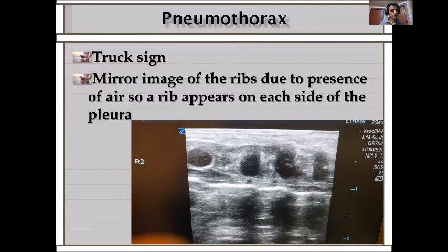The positioning. Remember, we will talk. We have 1, 2, 3, and 4. That's all it will do at this point. Don't do more than that. So upper, lower, axilla, and the diaphragm. 1, 2, 3, and 4: upper chest, lower chest, axilla and diaphragm.